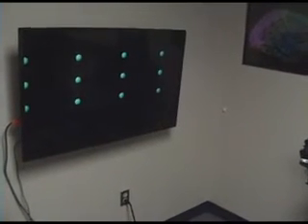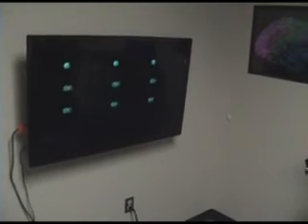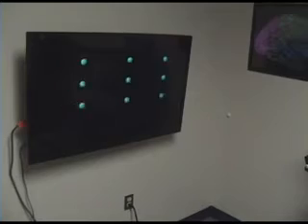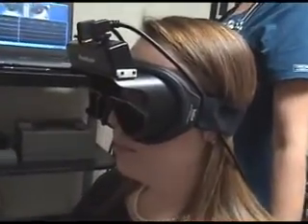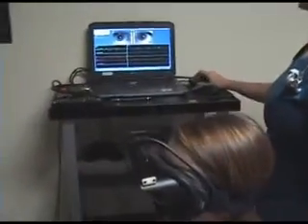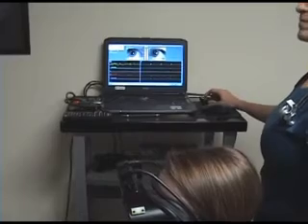And so essentially this is a very important test that looks at brain function on the right side and the left side. It also looks at some of the generators that can be affected in the brainstem. And so what will happen is the patient's eyes will be following these, so a very important test. And so let's go over some of the OPK graphs from the VNG.